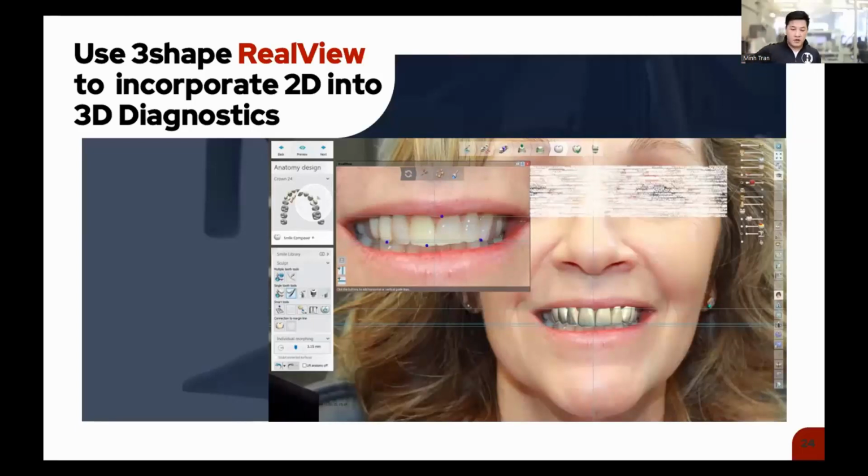And then, of course, you can overlay your design and say, you know what, I have a little bit of a cant that's going up this way. Maybe the patient's midline is skewed this way. So we can rotate it. We can say, oh, you know what, this tooth shape, I liked it for the teeth because that's how their teeth have worn down over the years. But looking at their actual face, maybe they need a more ovate style or more triangular, whatever you may prefer for that patient, right? Or it needs to be a little bit closer to what the smile design was.